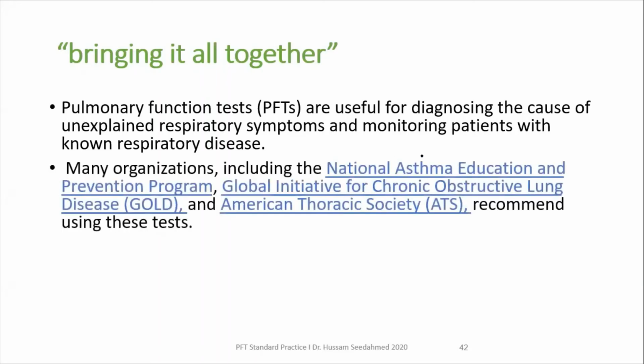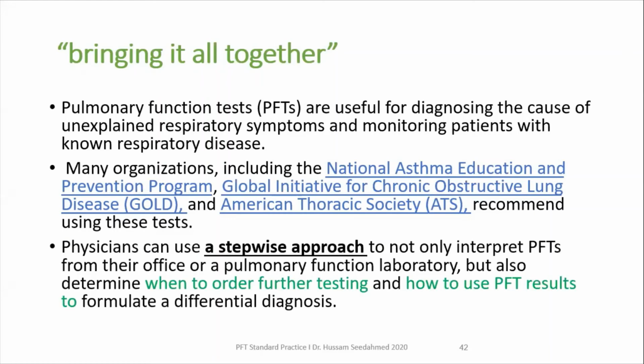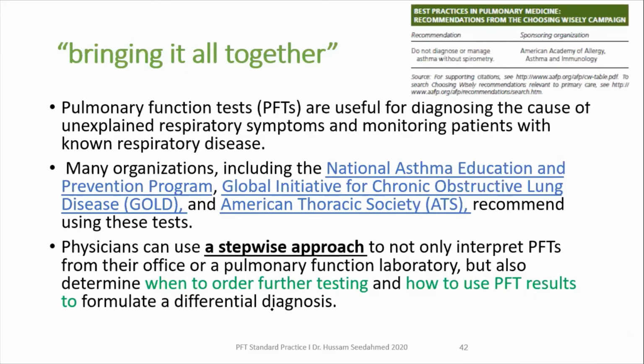Many organizations like the National Asthma Education and Prevention Program, the GOLD, the ATS, all of these recommend to do PFT. So you need to have a stepwise approach, not only to interpret the PFT from the office or the pulmonary function lab, but also to determine what further tests you need to run, and how to use the PFT result to formulate a differential diagnosis.